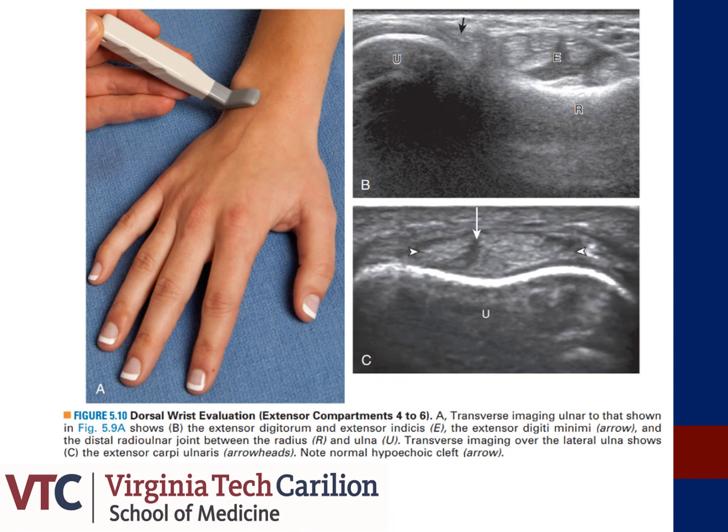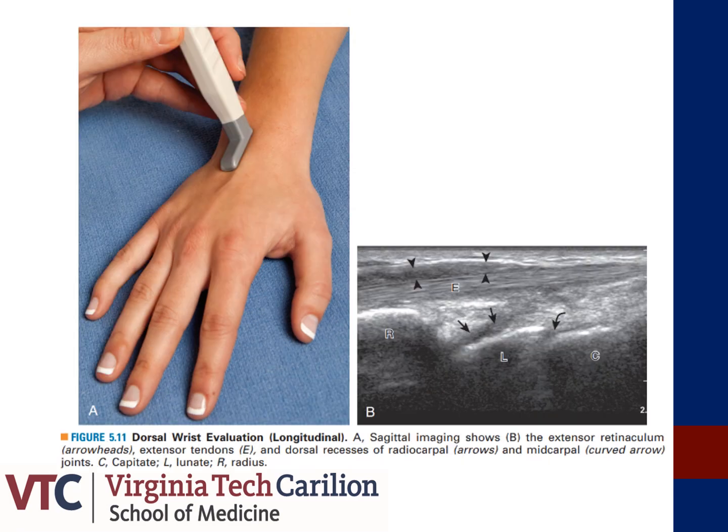These images further elucidate the ulnar extensor compartments. Figure B demonstrates the relationship between your fourth and fifth extensor compartments, and figure C shows a normal appearance of your extensor carpi ulnaris. Here is a view of your extensor compartments in a longitudinal axis.